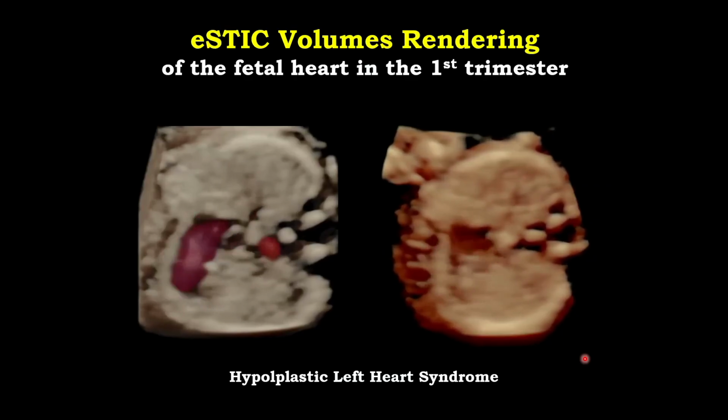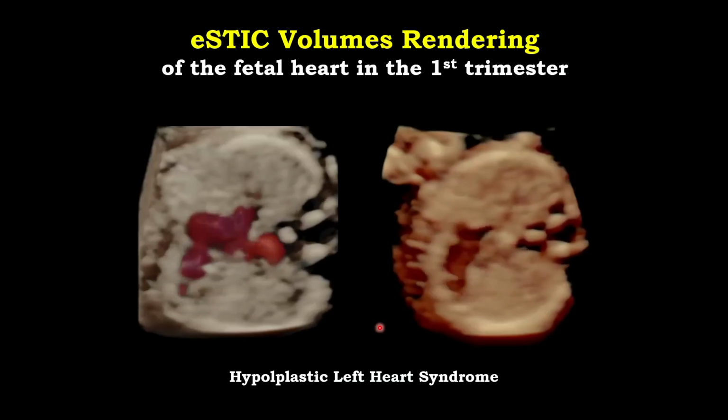So then you have this type of clinical situation, that the history and the pregnancy being that valuable, you absolutely have to be sure that if you deliver such bad news, you are confident in your diagnosis. And I think that the 3D definitely helps us to make it obvious and improve the communication with the patients, because this is very vividly showing what's wrong with the heart.